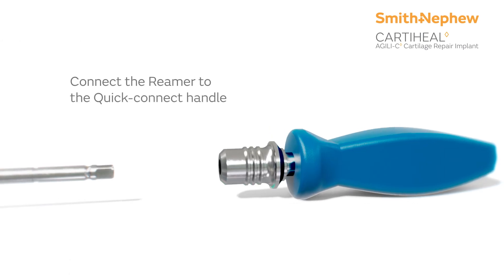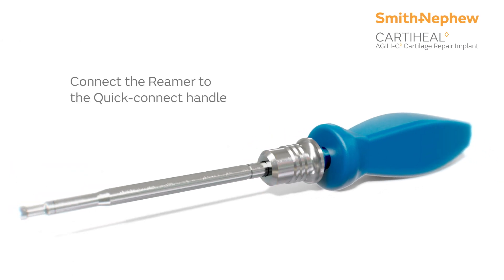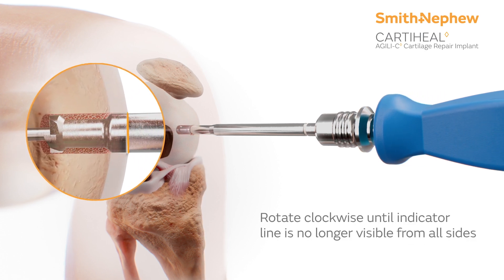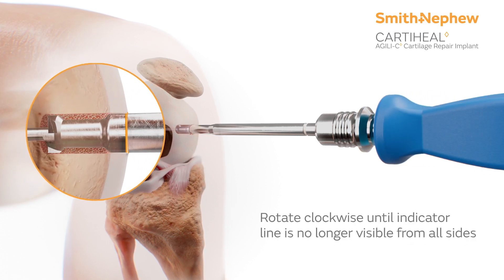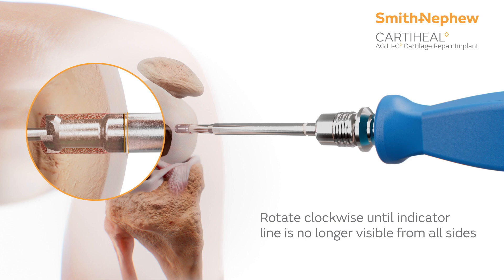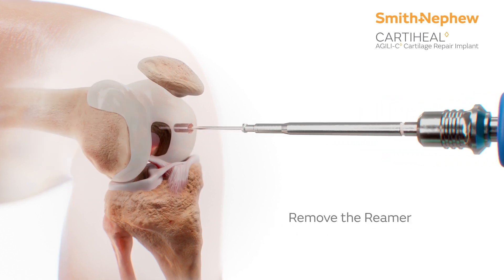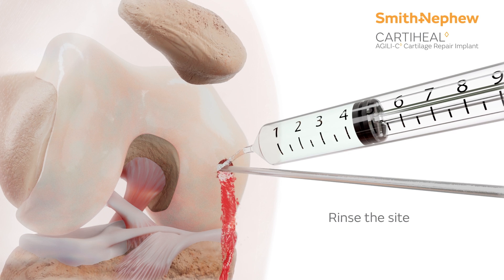For the next step, securely connect the reamer to the Quick Connect handle and rotate clockwise until the laser line is no longer visible from all sides to ensure the correct depth. Then, remove the reamer.